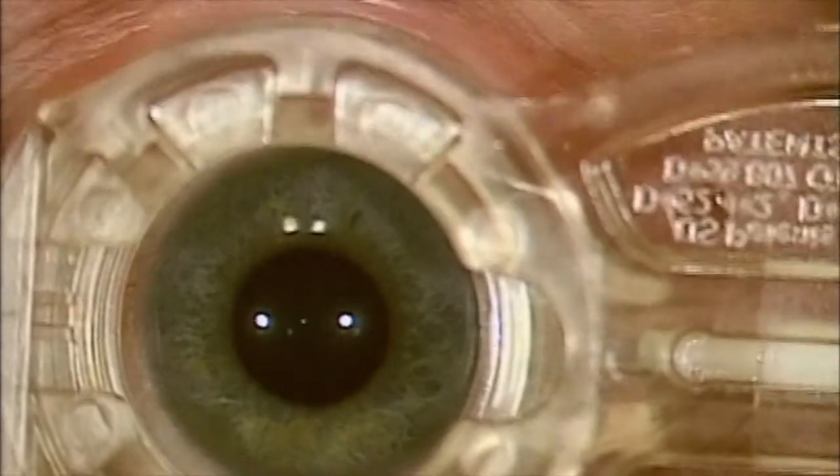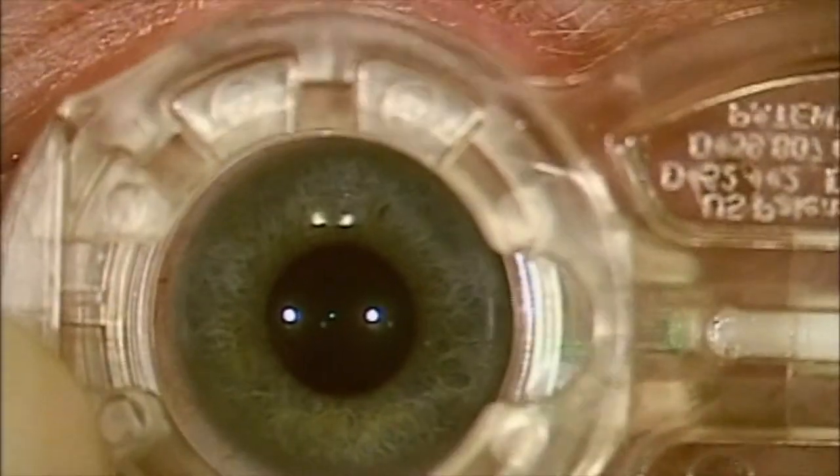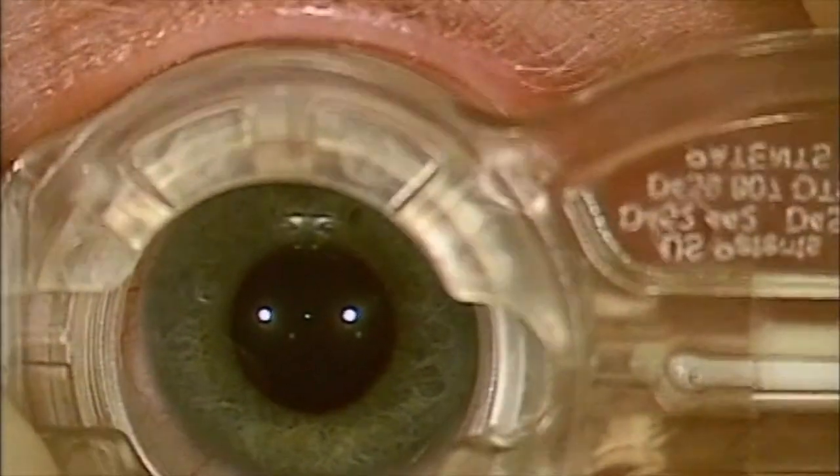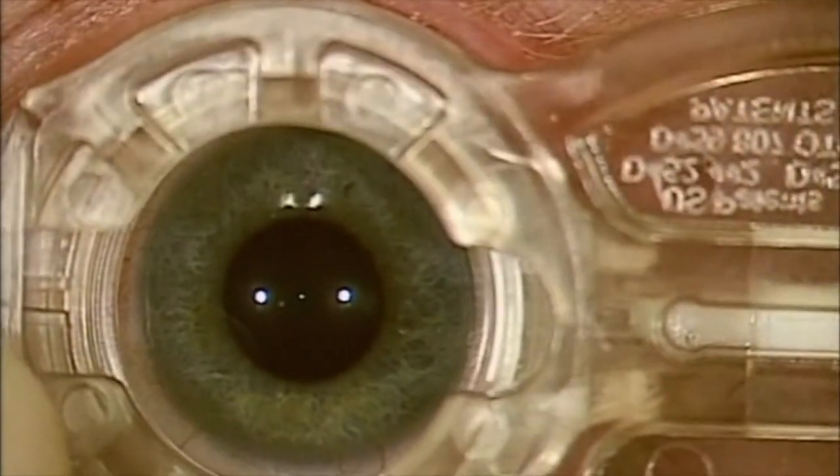Lift that lower lid up over the bottom of the interface, and then you're ready to come into high magnification and have a good look at centration there with the patient fixating on the fixation light. Then use the index finger from the other hand directly on the interface.